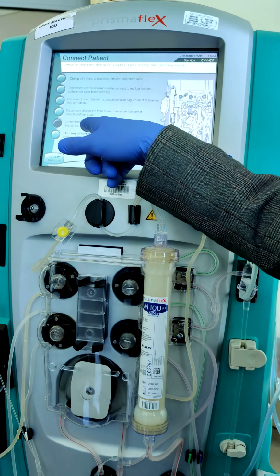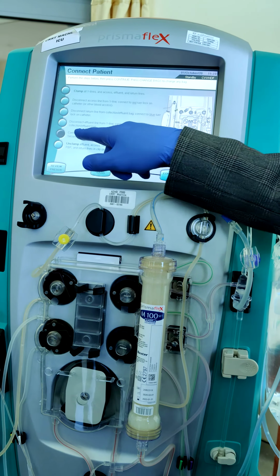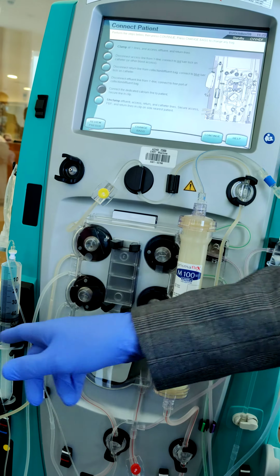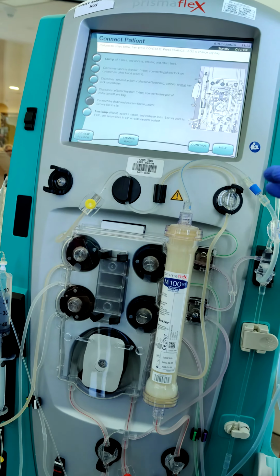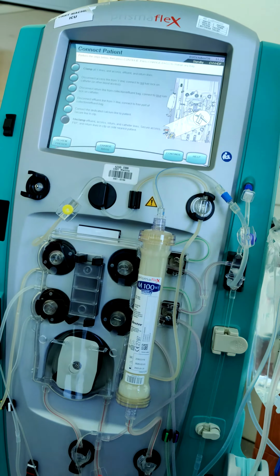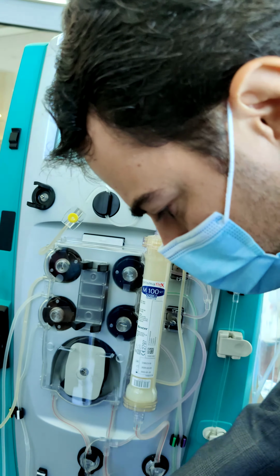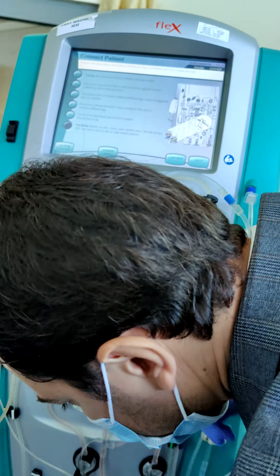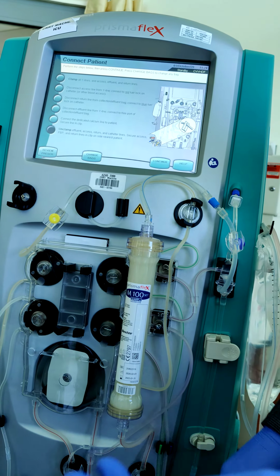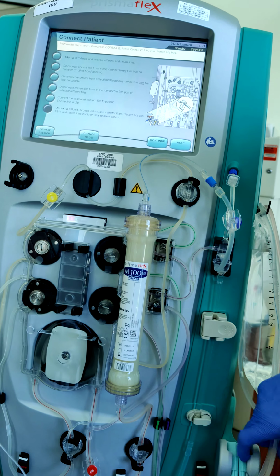Now, this is one extra, new instruction here: connect the dedicated calcium line to the patient and secure the line in the clip. Unclamp all those clamps. Here we also have a clamp on the calcium line. This one is new. You can keep this clamp on the patient side if you want.